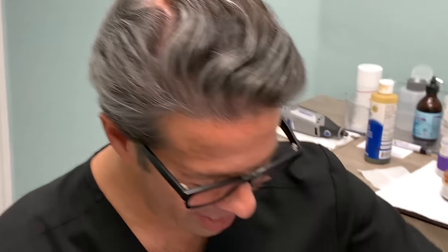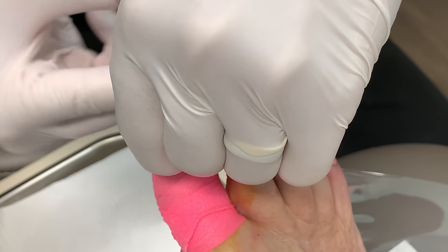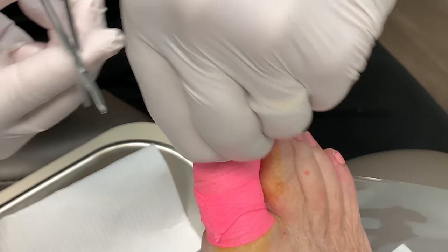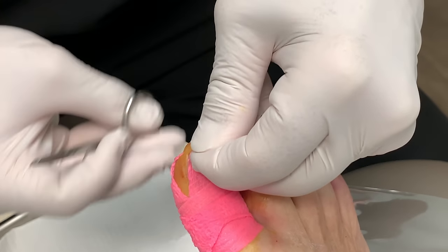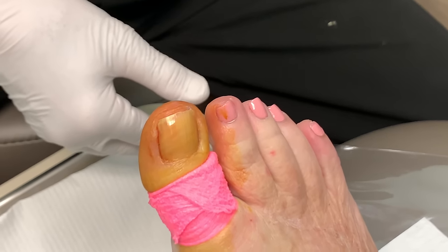The patient wants us to do this one first. Let's open this up and test you to make sure you're numb. I numbed her up, but when we were putting the betadine on her, she said that it may not be totally numb, but we're going to find out right now.